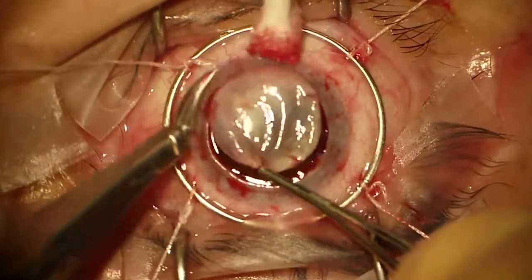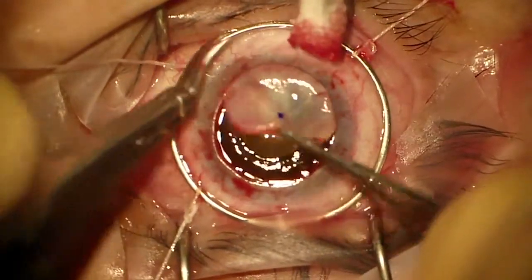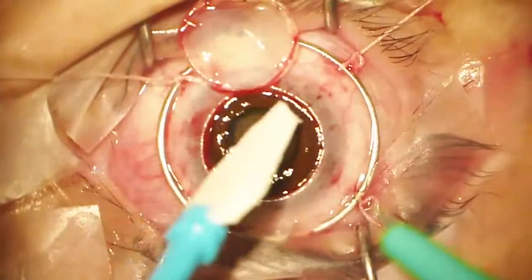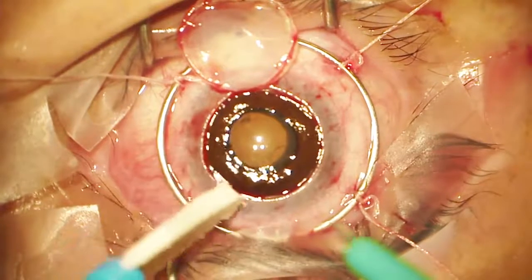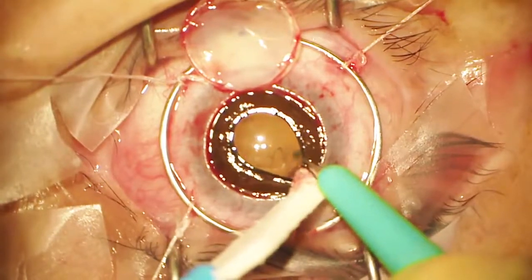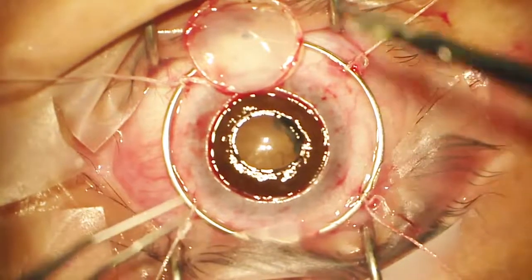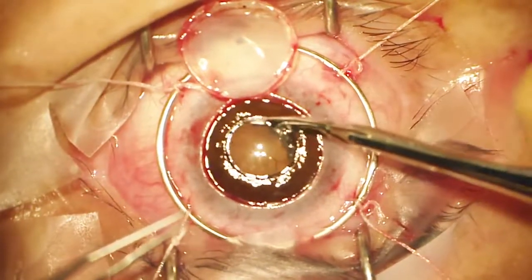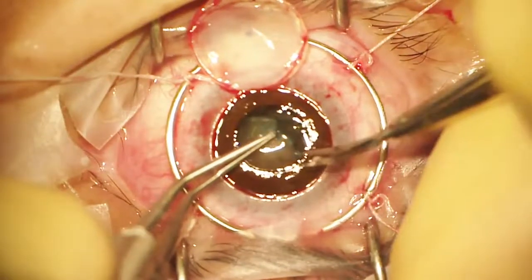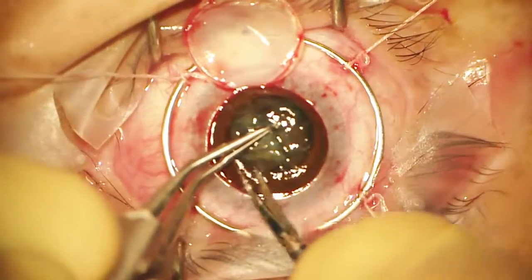She has a reasonably clear lens, but of course we have to take the lens in order to put in a prosthesis. I'm going to leave the cornea hinged. So we're going to do an extracapsular extraction. First we'll do a small anterior capsulectomy. So there is a little bit of posterior pressure here. And there comes our lens.